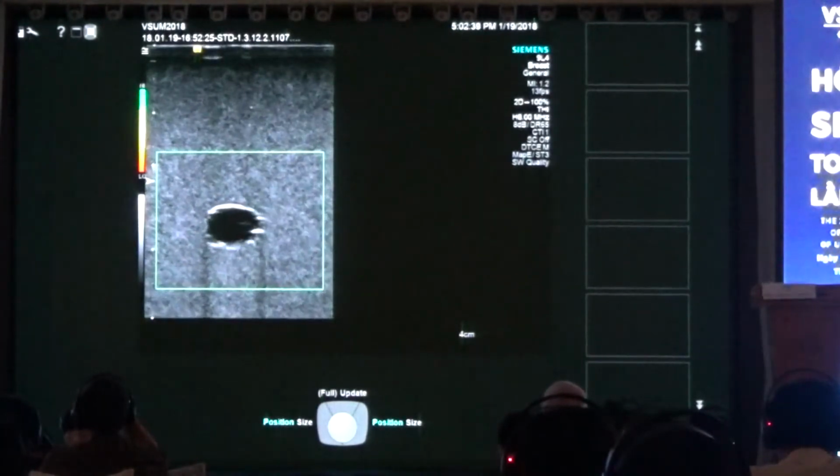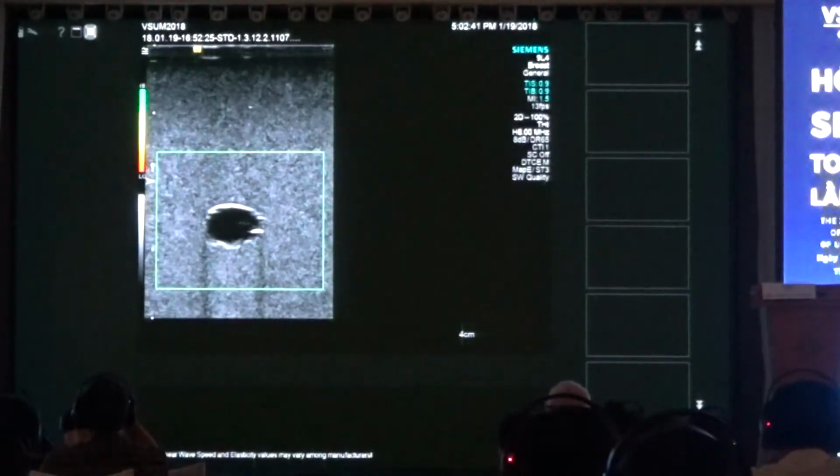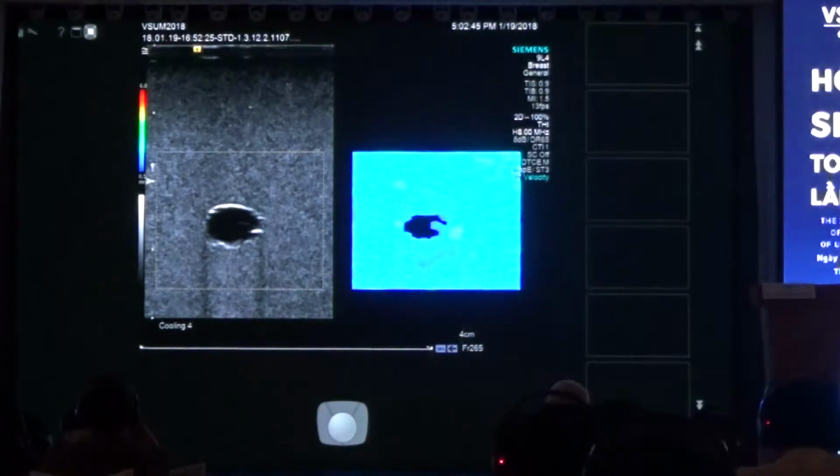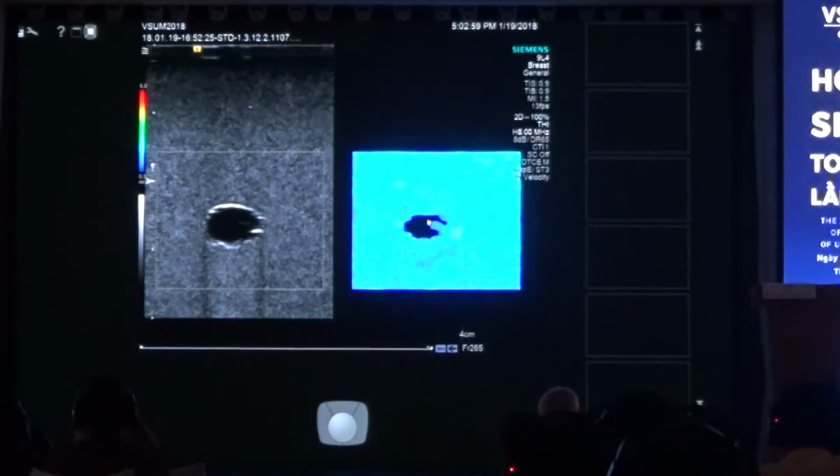Another thing that we didn't talk about was if we do a cyst on 2D shear wave, I said simple fluid does not conduct shear waves. So you can see here that it's black on the velocity map. It's telling you it's like XXX on the liver's. I couldn't count, the computer saying I can't calculate a shear wave speed.